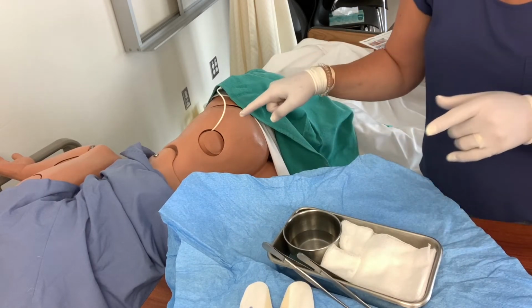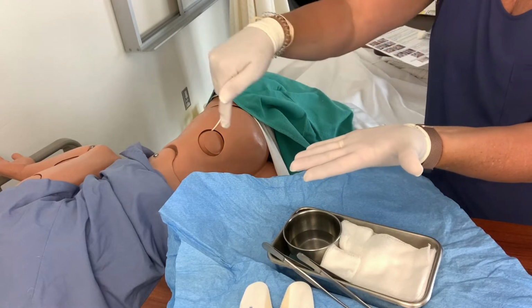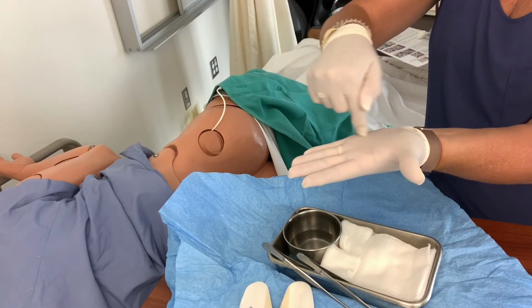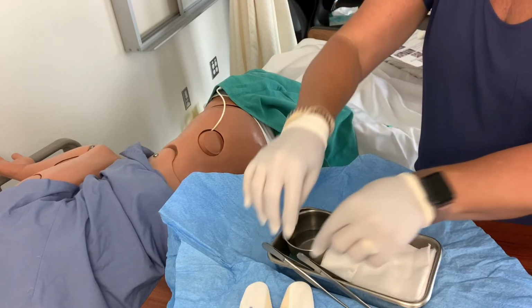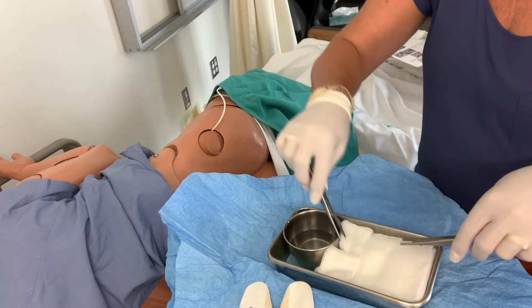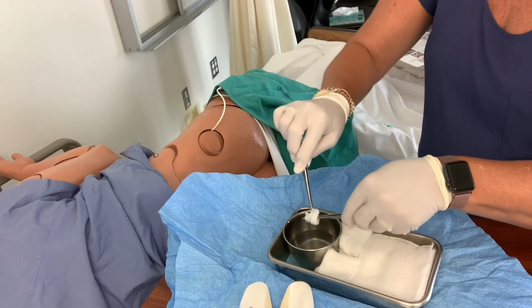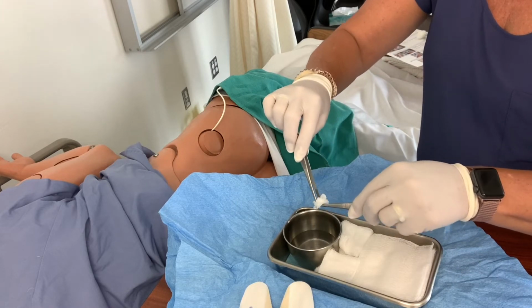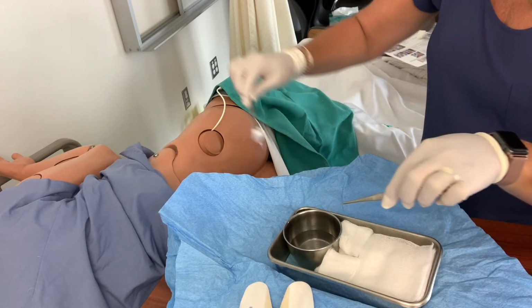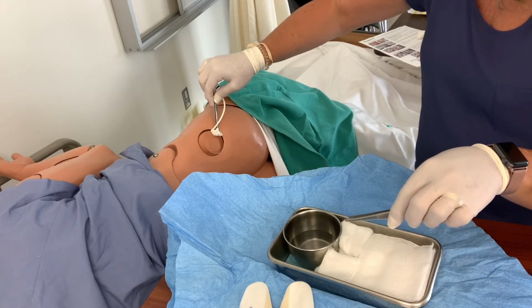What I want to do is clean the insertion site, and I want to clean from the site outwards. So I'm going to go at the site and clean around, about the size of a tennis ball, and move my way out. I'm going to clean with sterile saline. So I'll gather up a little ball of gauze here, start at the insertion site, and just work my way around.